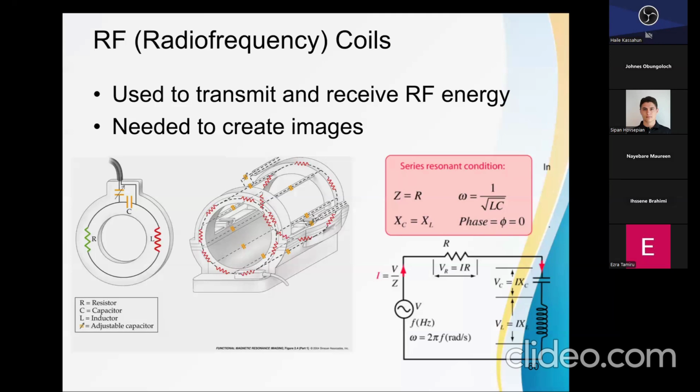The thing that you can easily vary is the capacitor. So you can easily solder and desolder and put back capacitors into the system, or you can have variable capacitors that you can easily adjust within the system. So the capacitor then becomes a very good ally of ours, and therefore the resonant frequency is set mostly by the capacitor, because as I said, your inductor is almost in there already when you do the winding of the coil.